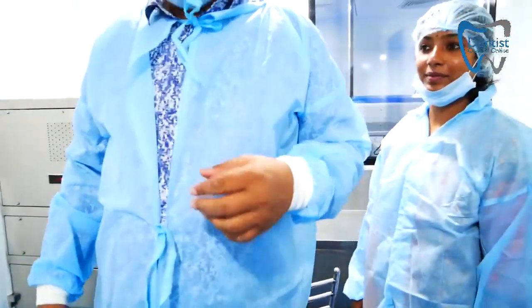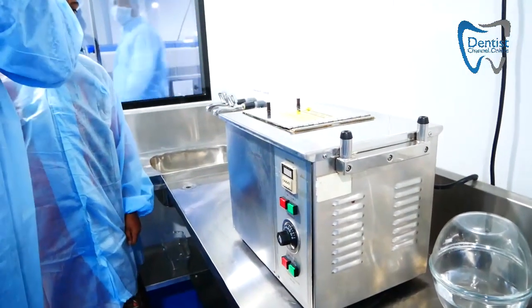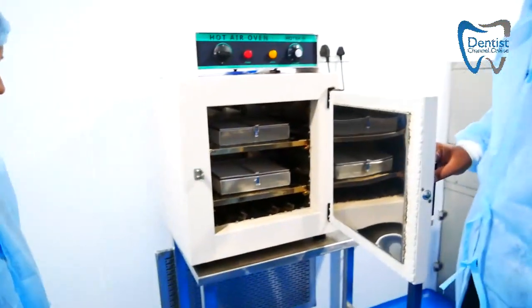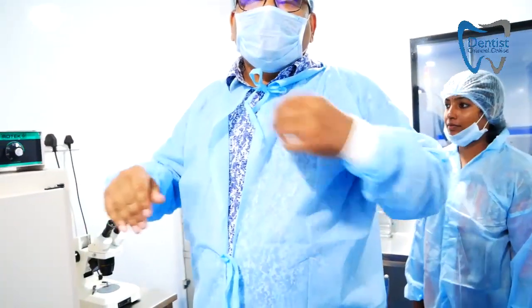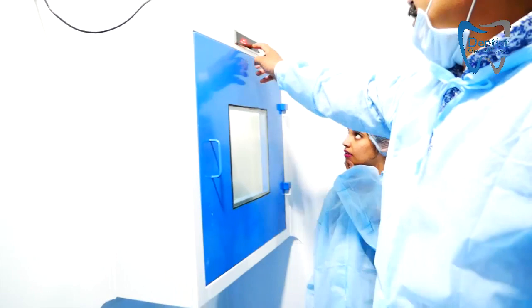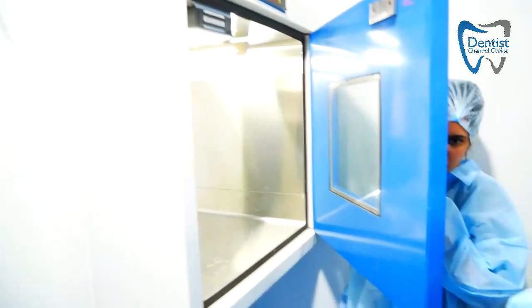First, the implants go through hot water ultrasonic cleaning, which removes all the oil. After that, they are dried with a hot air dryer. When the hot air is applied, the surface becomes clean and dry. Our primary objective is to remove the oil from the surface and dry the implant so it is ready for blasting. This cleaned, dried implant then goes to the next room.